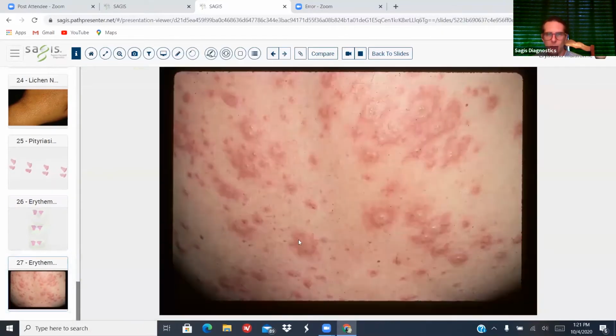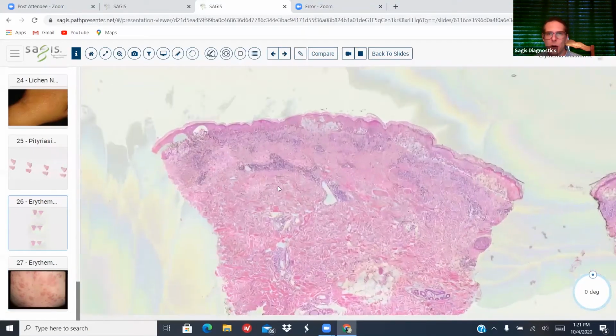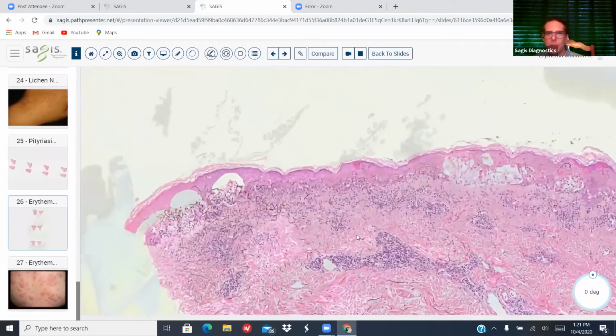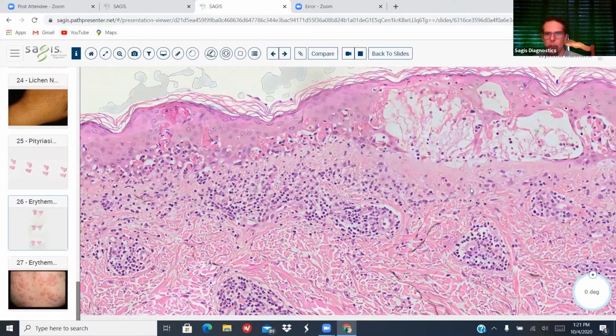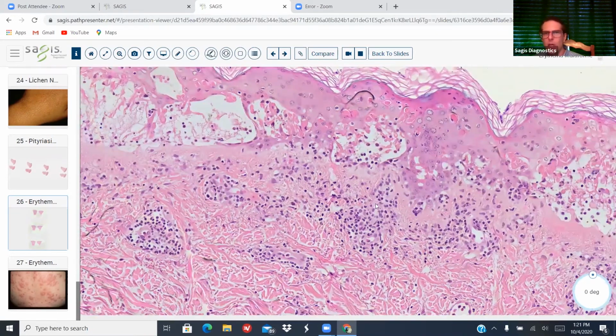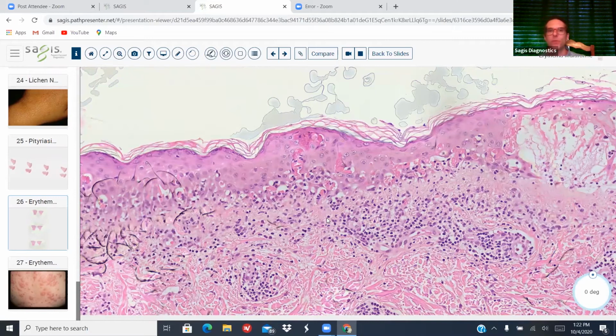Here's the clinical photo. So here we know it's erythema multiforme. Remember though that even urticaria multiforme can look like this clinically, and then you biopsy and it's superficial perivascular with eosinophils and no necrotic keratinocytes, and it's not EM, where this is EM. And so, you know, it's more of a clinical distinction of differentiating EM major from Stevens-Johnson, whether there's oral mucosal involvement, whether the patient has Nikolsky sign, do they have macules instead of papules? Usually if it's more papular, it's more likely EM major.